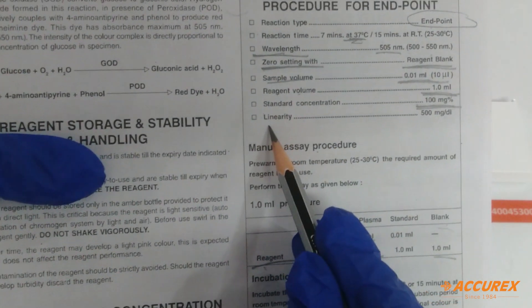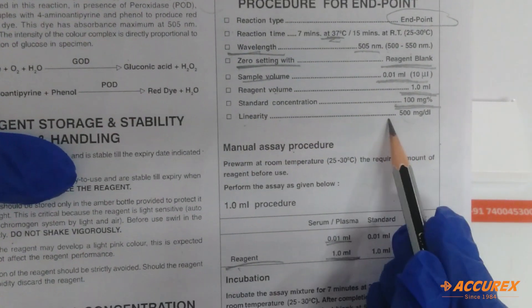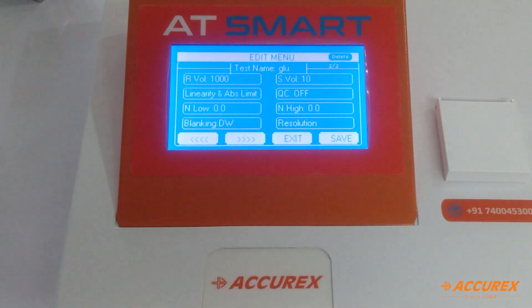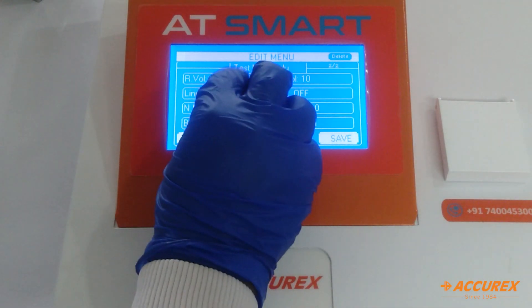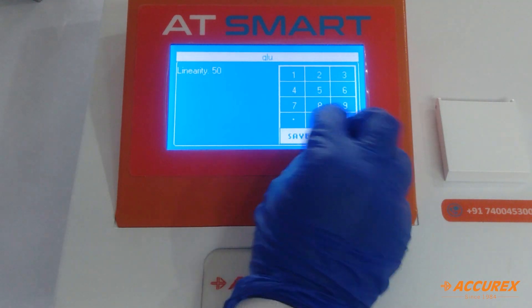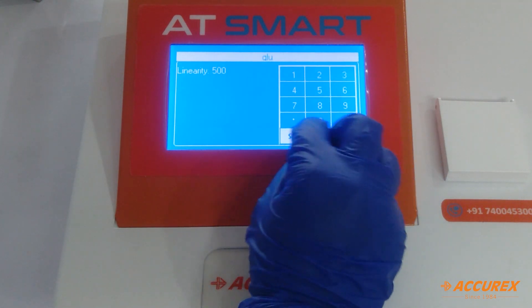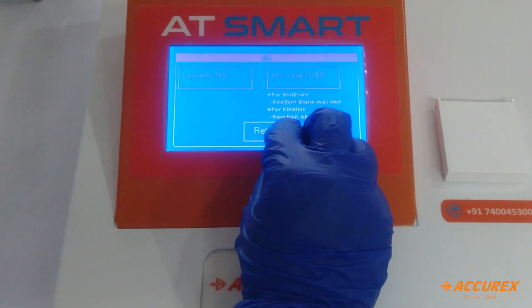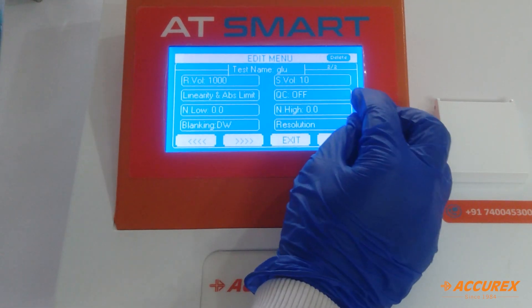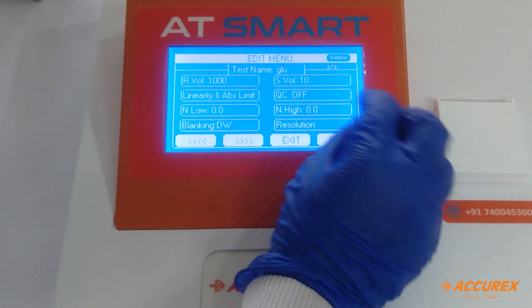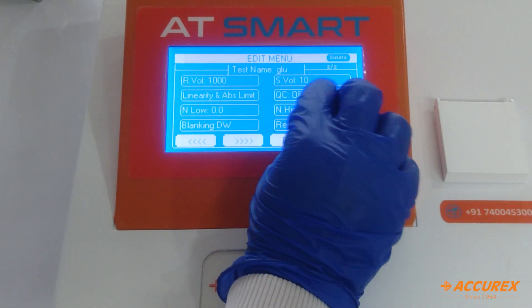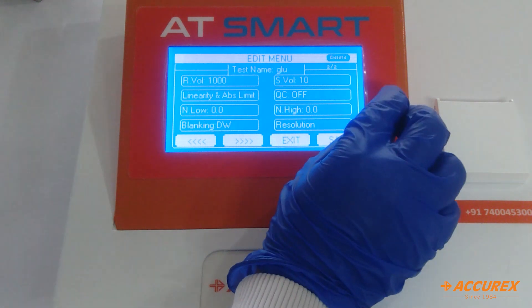Now linearity — because glucose has 500 mg per dL linearity, press 500 and save. And QC: if you want to check QC, you can turn on or off the option.